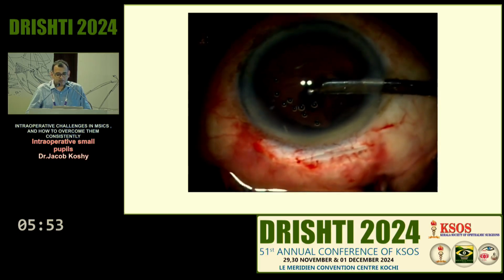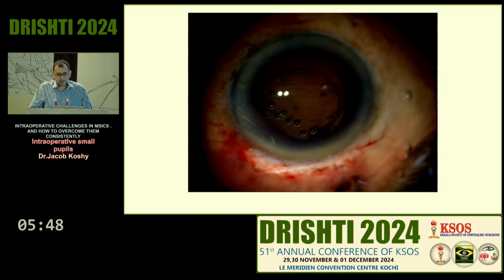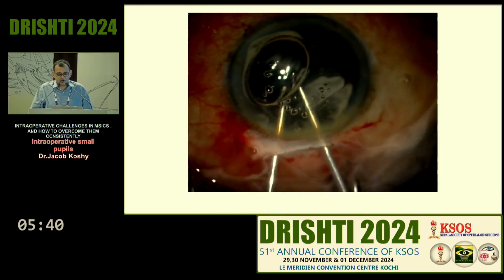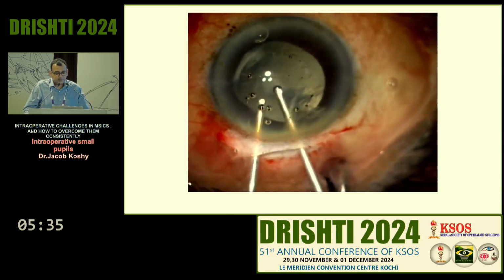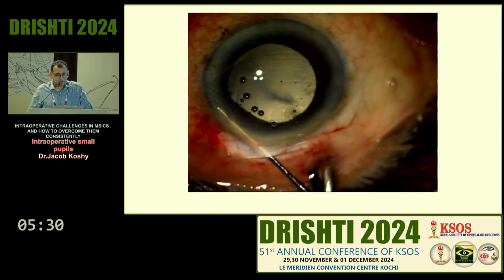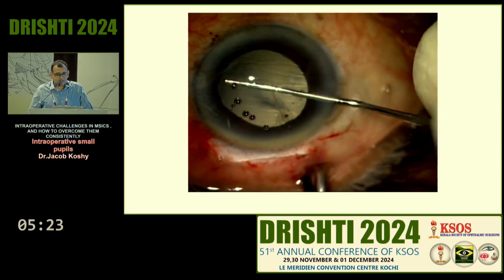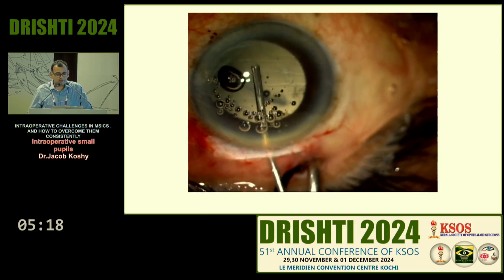At this point of time, I'm feeling a little more confident that I should be able to manage it as things are getting better. I keep removing the viscoelastic. Again, I put a little bit of triamcinolone because I want to make sure whether I have brought out any more vitreous. Do a good anterior vitrectomy. Sometimes this triamcinolone might go a little back, and on retro it will look a little white, and you might start wondering, oh, have I caused a detachment or anything, but generally they are okay. Remember to keep sweeping on top, and you can see a little bit of vitreous tag there, things like that, so that you know what to remove.